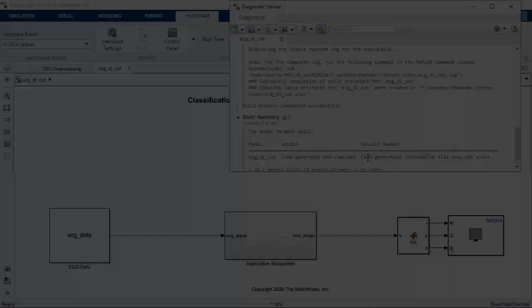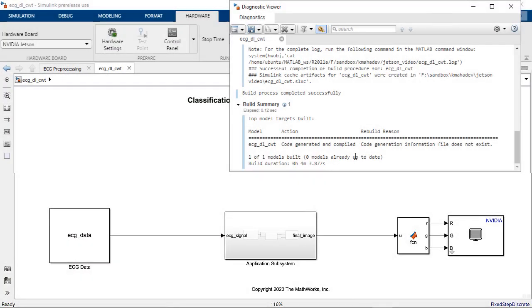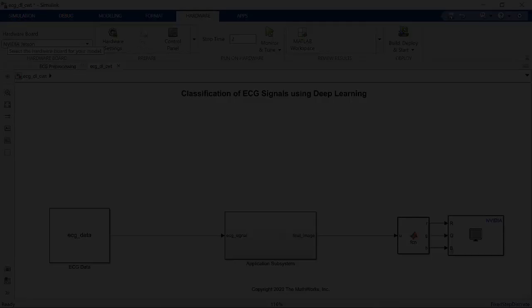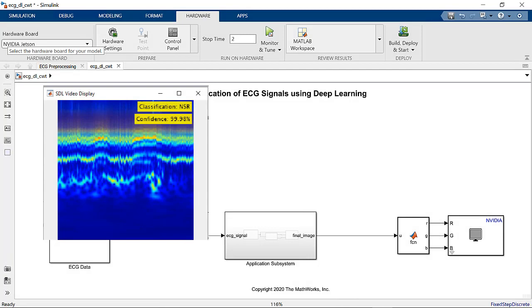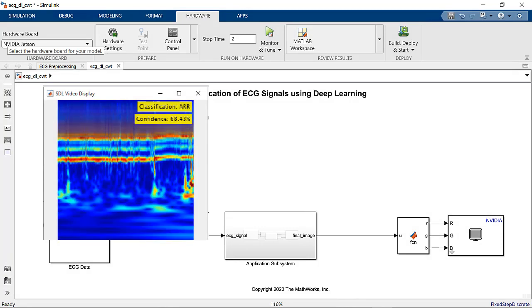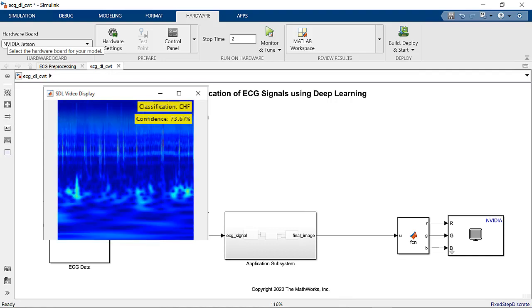Here you can see the output from the diagnostic viewer showing us that we have compiled the application and it's running on the Jetson Xavier. The SDL video display here streams the output from the Jetson board. And we can see that the displayed results match the simulation results.